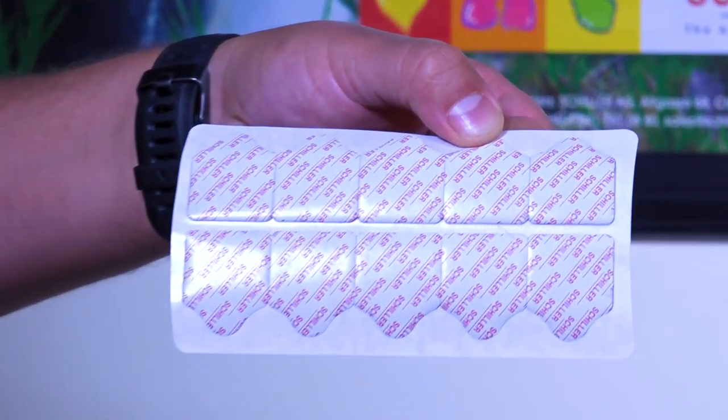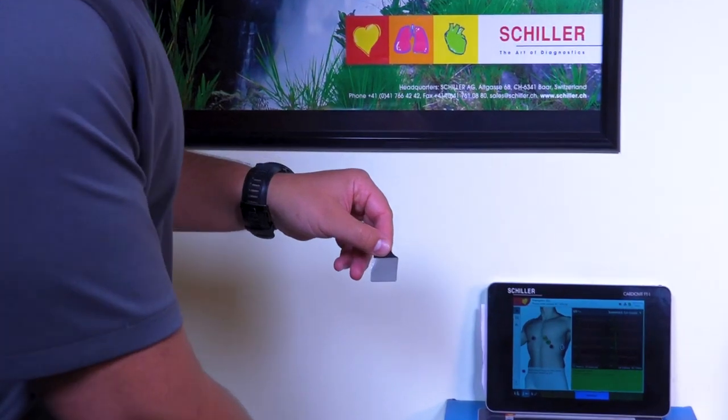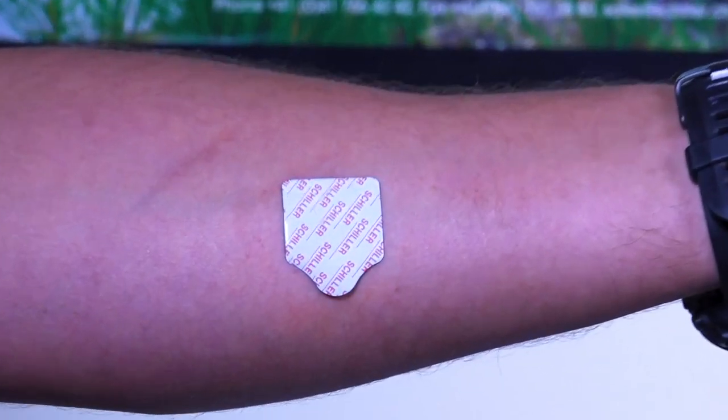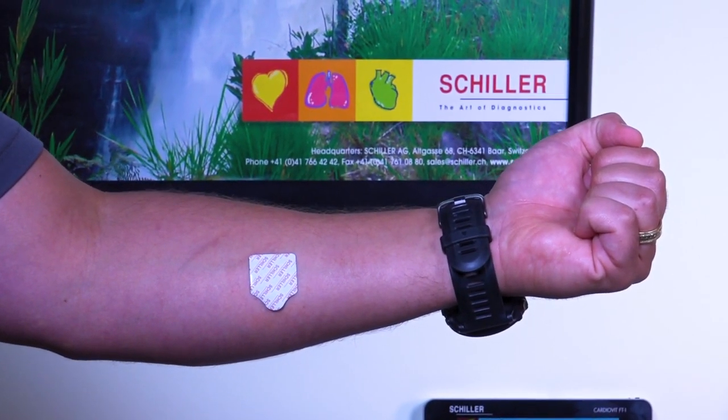The Schiller electrode has the ideal size — not too big or small. It fits any thorax size, from children to adults. Our electrode contains the highest grade of silver chloride gel to ensure the best conductivity and thus the best ECG quality.